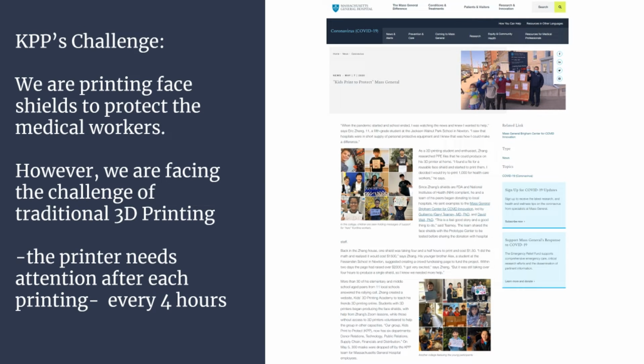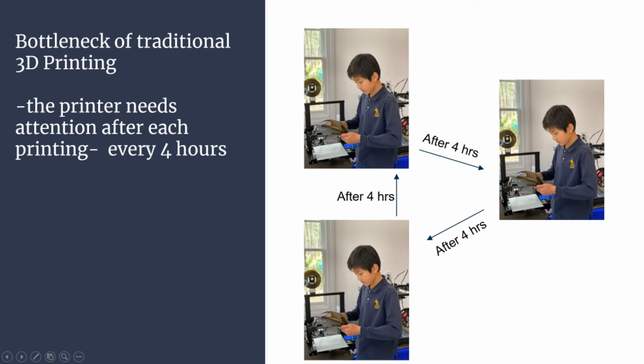In our KPP initiative, we have been 3D printing face shields to protect medical professionals. Our team has been working tirelessly to 3D print face shields, but there is a challenge. After the printing is over, you need to check on the printer and take the prints off. And you have to do it every 4 to 5 hours.